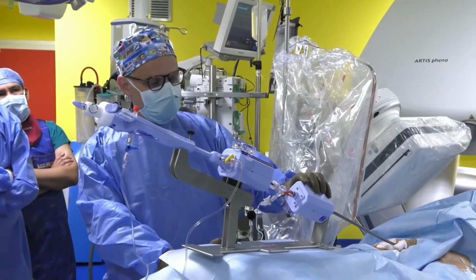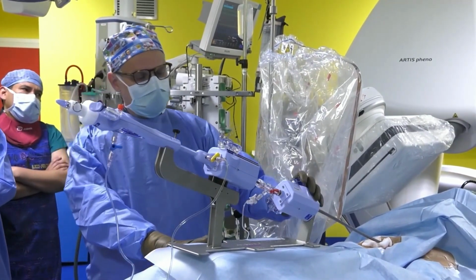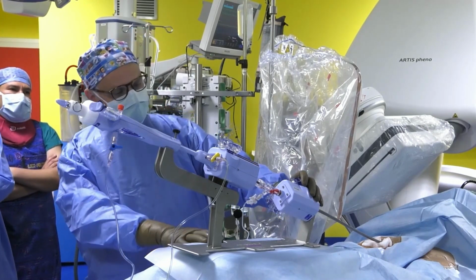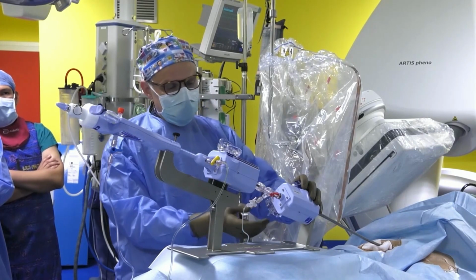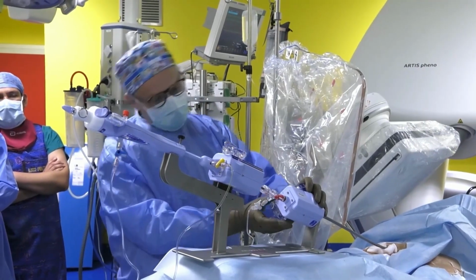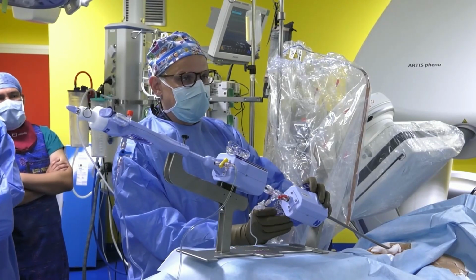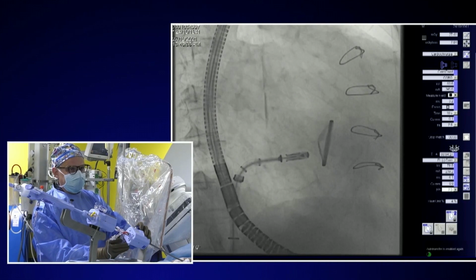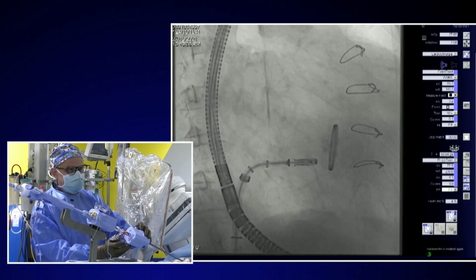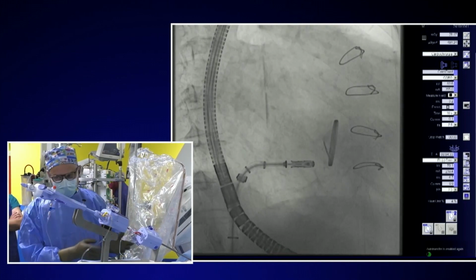is done with the improved TriClip guiding catheter, which has basically two knobs. One is a plus-minus knob. If you apply minus, you basically bring the system away from the tricuspid. If you apply plus, you bring the system towards the tricuspid. This is in this particular patient today.